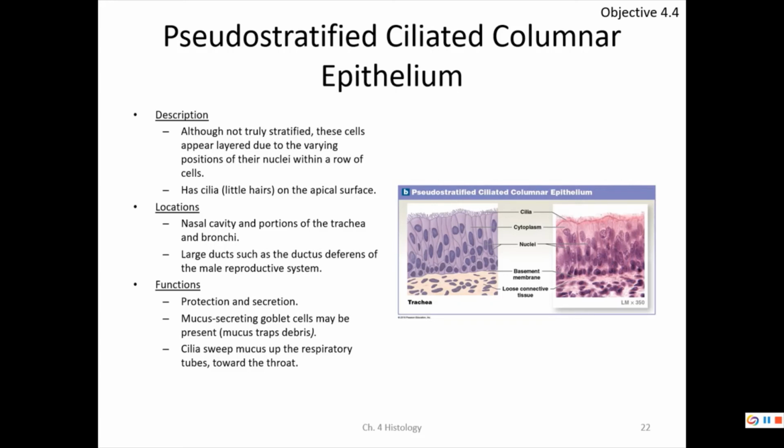Yes, a vas deferens. Every now and again, I've got to throw something in here funny because I'm telling you guys, I know it's stressful.